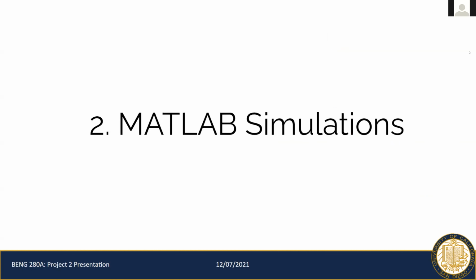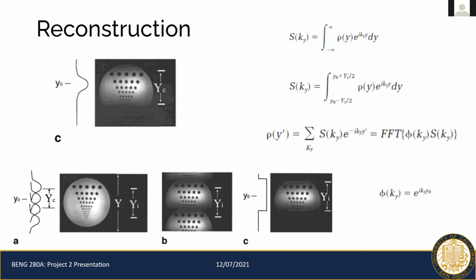And since we assume absolute local sensitivity for each coil, it is really not realistic. And there will be overlapping regions like you see in figure A. So there will be margins of errors, we will produce artifacts, as you can see later in our presentations.